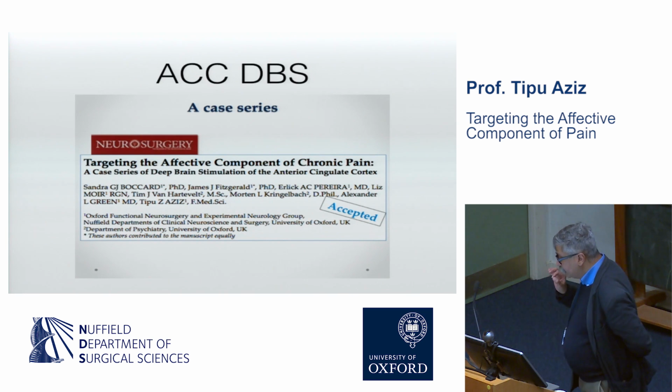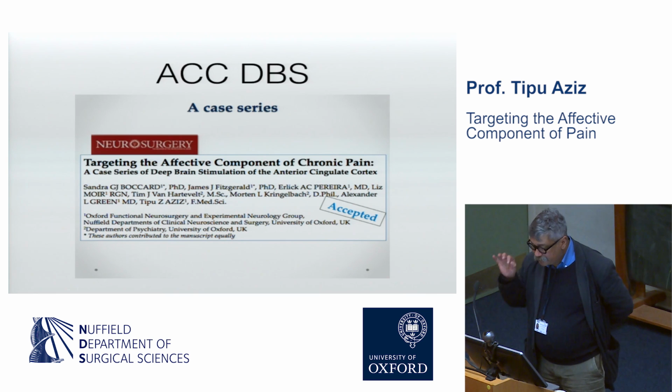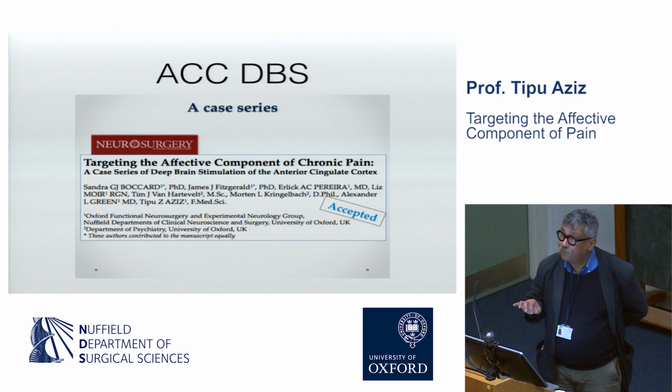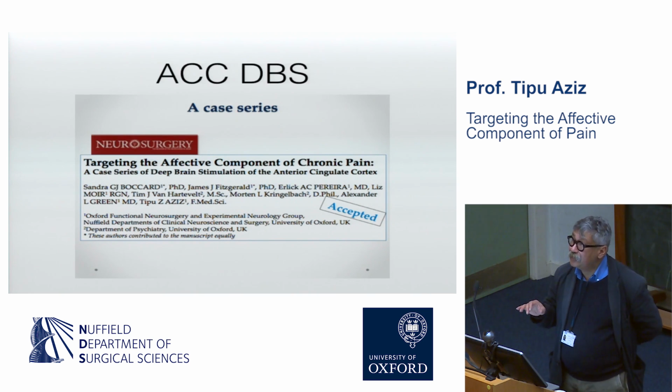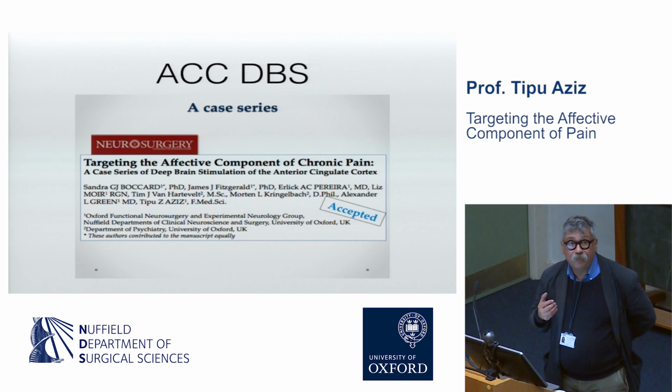And it had the most phenomenal effect in these patients. When we implant and stimulate, they don't really feel much. And when we externalize and trial them, interestingly, nothing happens for about a couple of days. And then on the third day, when you ask a lot of these folks, what they report to you is that they are doing more. The pain is still there, but it doesn't bother them. And we carry on to implant.